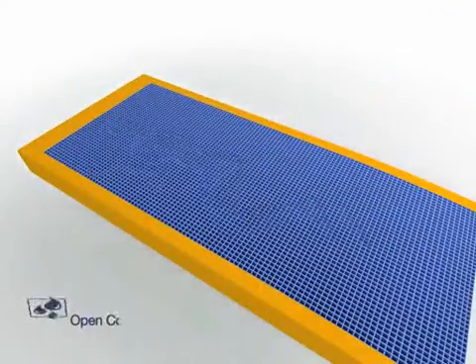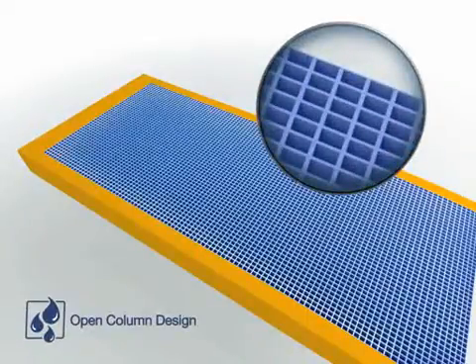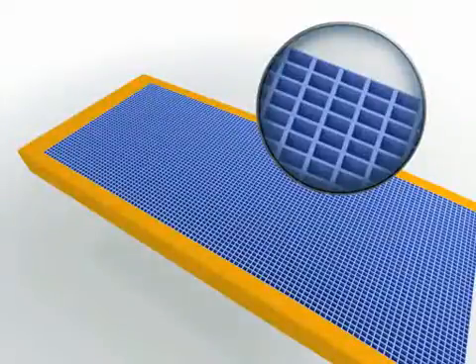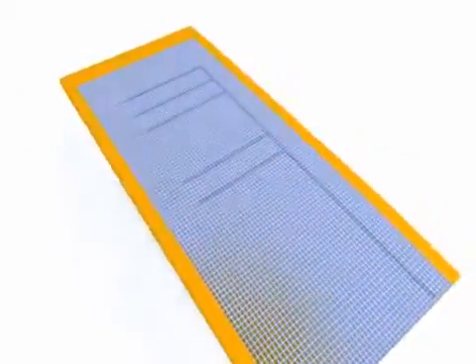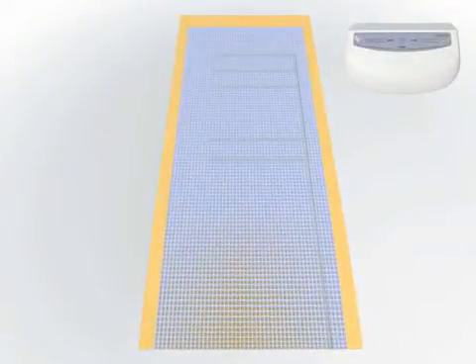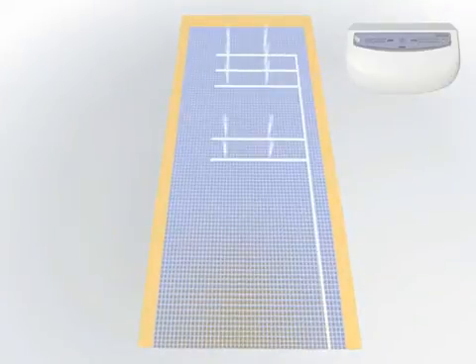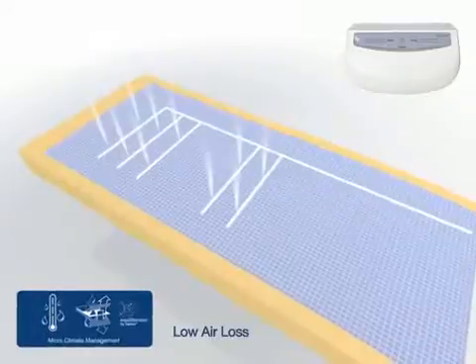Excess moisture on the skin can negatively impact the integrity of the skin, causing it to be more susceptible to breakdown. Low air loss provides a flow of air to assist in managing the microclimate — the heat and humidity of the patient's skin. The IsoGel Air Low Air Loss System delivers direct air to skin to the sacral region and continues air flow to the torso.